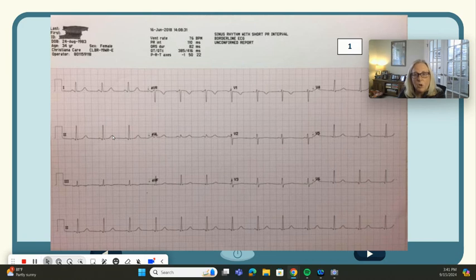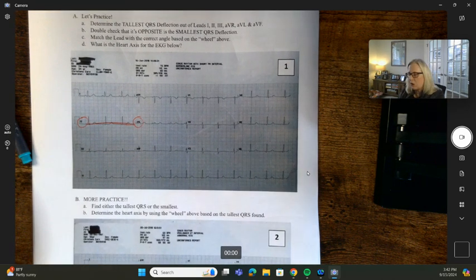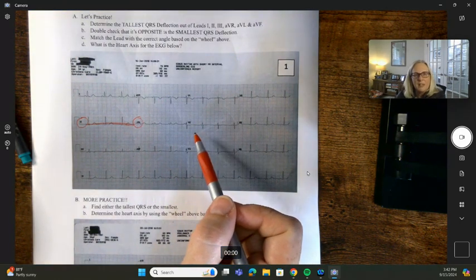On your number 1 EKG on your picture, I'm going to circle 2 and AVL as opposites. I'm going to link those 2 together. I'm going to show you my camera again. I know I keep flipping back and forth, but I'm just hoping it's easier for you. So here's my picture. This is your notes too. This is the same EKG that was on the slide.